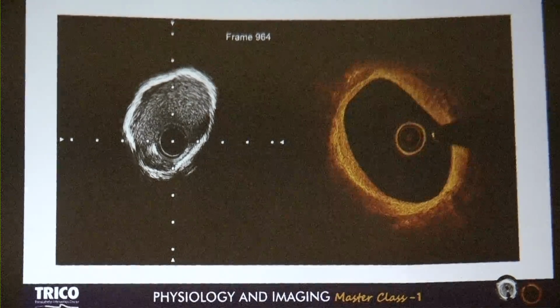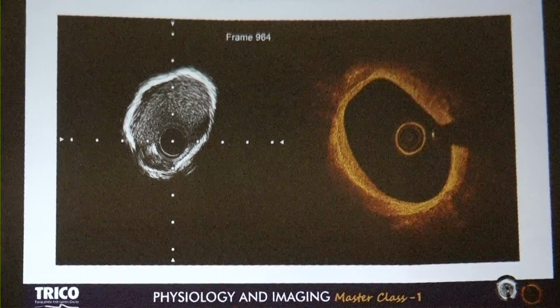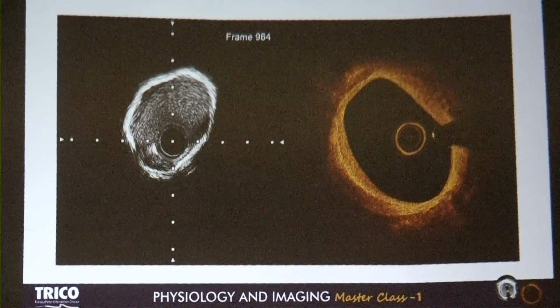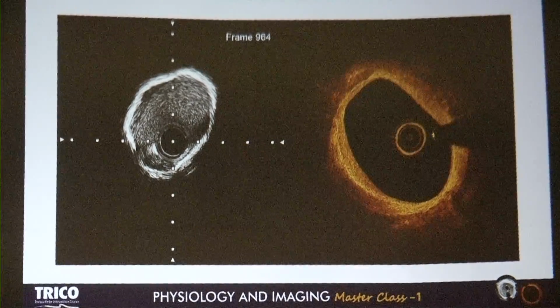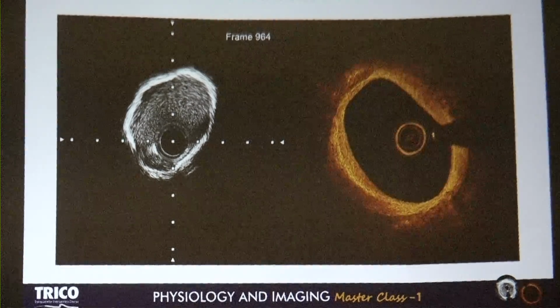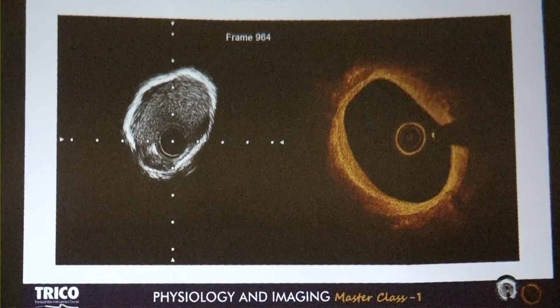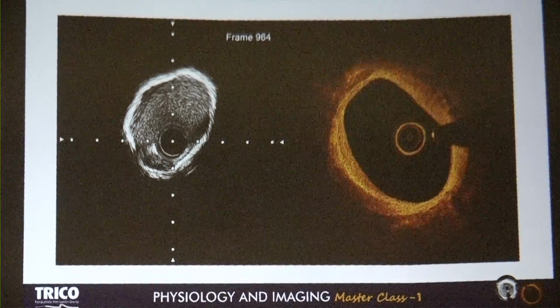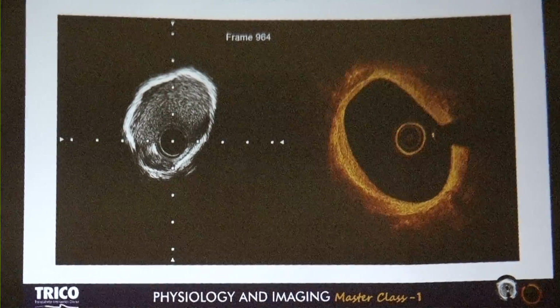Both the pictures have very well shown the calcification, which is significant enough, and it does require certain plaque modification. Yeah, but the significant amount is fibrosis, and in many areas the calcium is beyond the fibrosis part. Am I correct, Professor? And the thickness of calcium is also less.